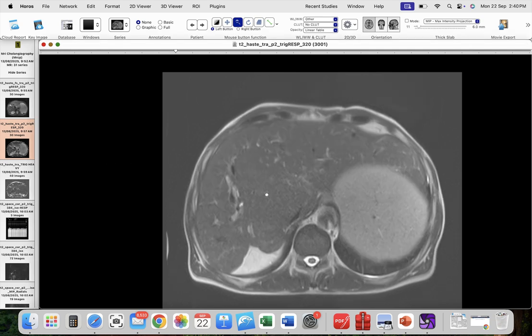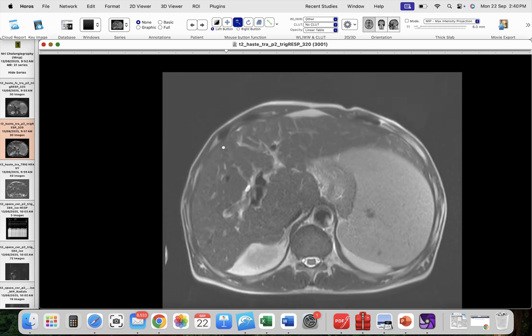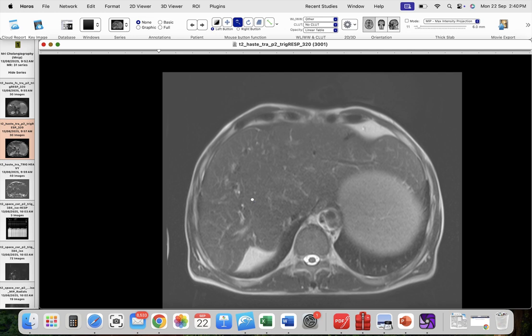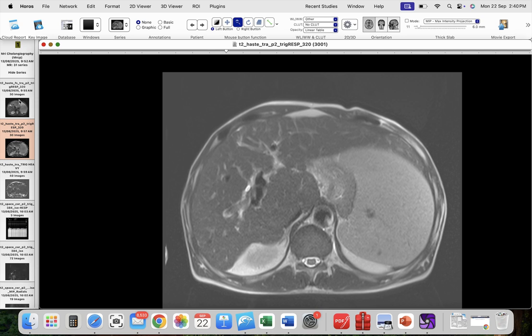Before we go to assess the gallbladder and the biliary system, we can give you a small hint about the MRCP sequences. Usually we depend on T2 based sequences to see the bile inside the biliary radicals as well as inside the gallbladder. The problem in abdominal imaging is respiration.